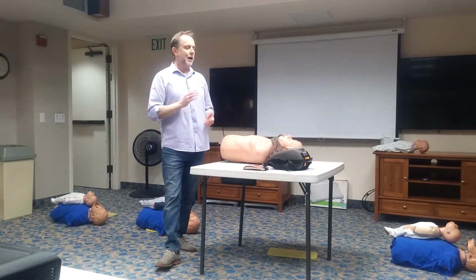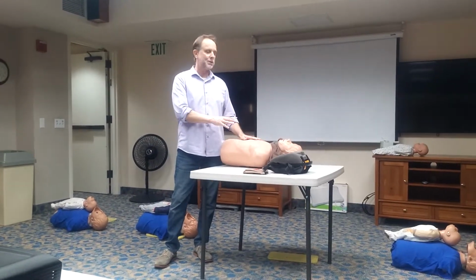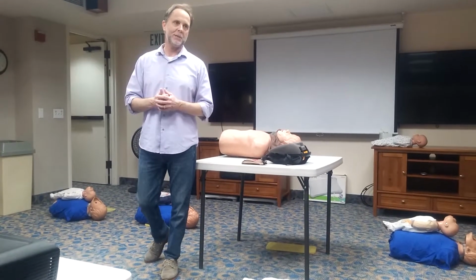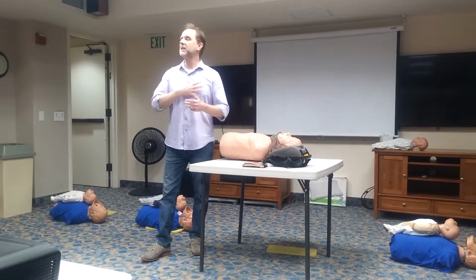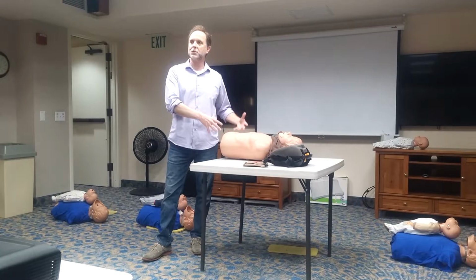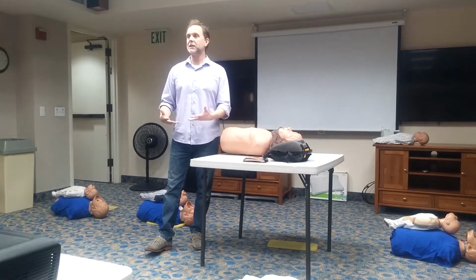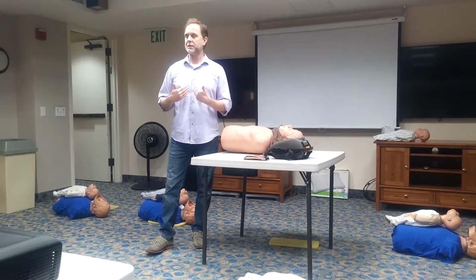Now, there are some special circumstances with the use of the defib. The victim's chest must be bared, male or female. If the victim is wet or in freestanding water, we need to dry their chest off first and remove them from any water source. If they're on a metal surface like a metal loading dock, we have to remove them. If I'm kneeling on a loading dock, pressing the shock button, what happens to me? I'm going to get shocked.